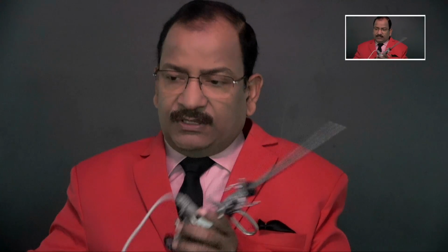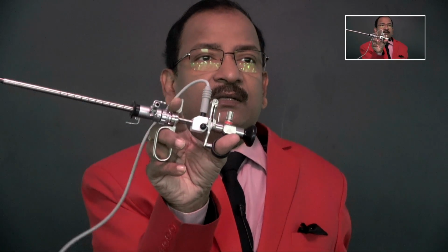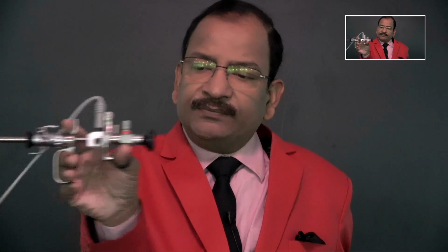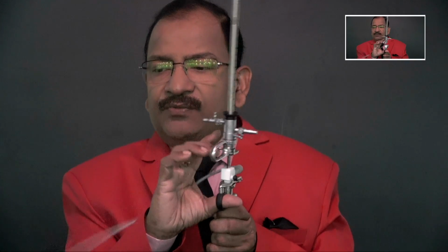So this is the complete resectoscope, and you will hold it. This is the way to hold. One finger should be here, and these 2 fingers should be here, and the thumb should be on the back. This hole is for the index finger, this hole is for these 2 fingers, and the thumb is on the back hole, and this is how you have to move the thumb.